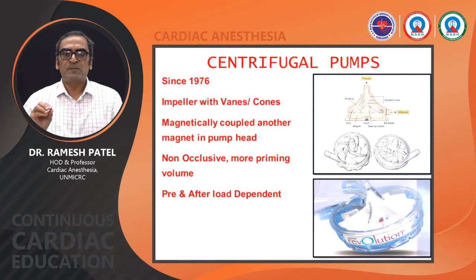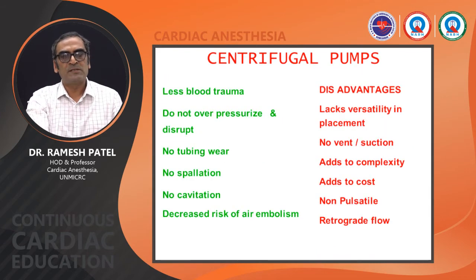These centrifugal pumps are preload as well as afterload dependent. So if the patient has a high peripheral vascular resistance, it will be difficult to maintain adequate flow. Of course, it is expensive, and it is mainly used in ECMO.